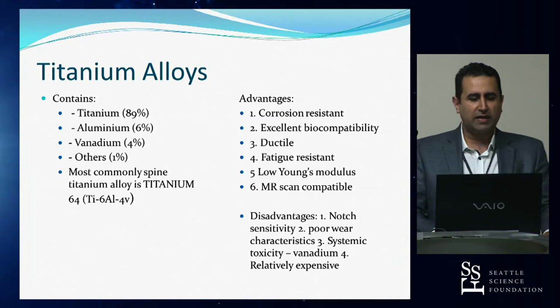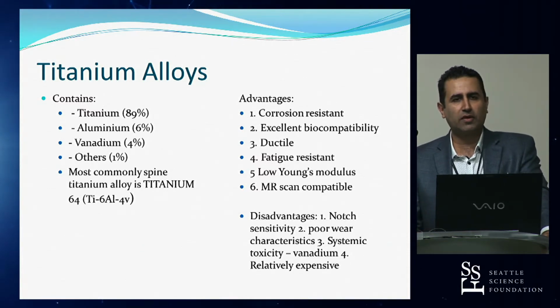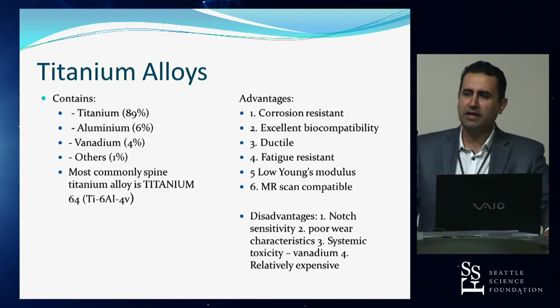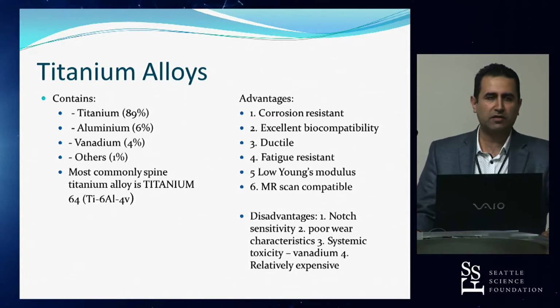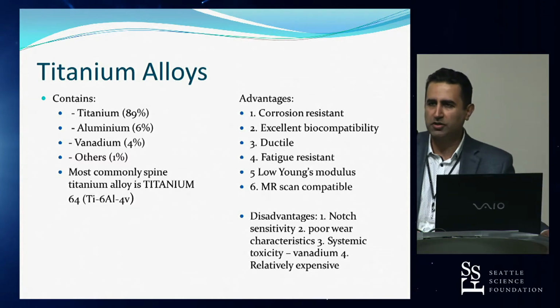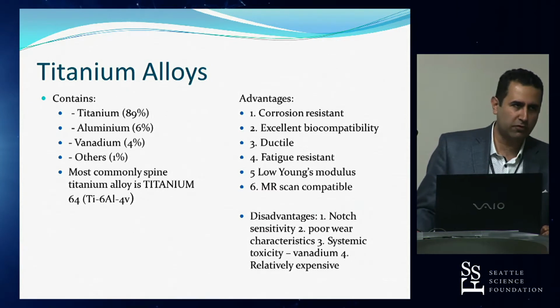So what about titanium? Now, pure titanium can be utilized, but typically the titanium screw or rod that you place is an alloy. It's made up of aluminum and vanadium, amongst other things. Again, it's very resistant to corrosion. It's fantastically biocompatible. It's ductile. It's got a low Young's modulus compared to steel. It's MRI scan compatible for the most part.